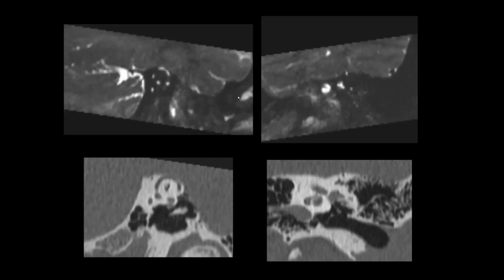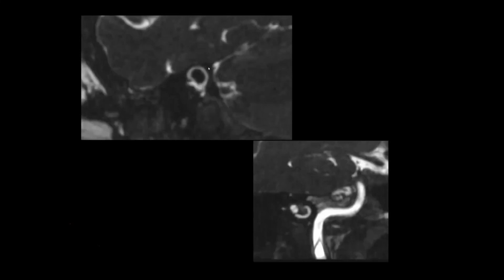But again, MR tends to overcall it. So if we see what looks like semicircular canal dehiscence, as you see on this patient, both on the Poschl and Stenvers view, we usually just recommend a CT if clinically indicated. And here on the Poschl and Stenvers CT images, you can see that there is confirming dehiscence of this superior semicircular canal. So again, MR tends to overcall. If we see nice bone, we can exclude this diagnosis. If we don't, we can recommend CT.